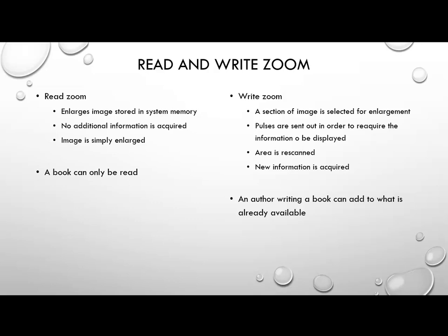And I like to think of it as a book, okay? You can read a book, but you can't change the words in the book, all right? The book is just what it is. Write zoom, on the other hand, is when we select a section of our anatomy and we are going to enlarge it utilizing ultrasound. And so we use write zoom and we start sending pulses into that area, and we rescan the area and obtain new information and display it larger. Okay, so that's a write zoom.